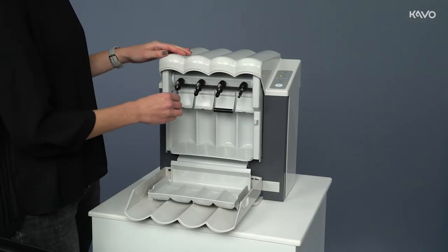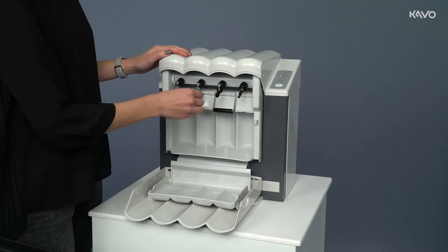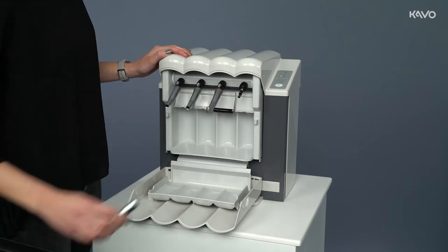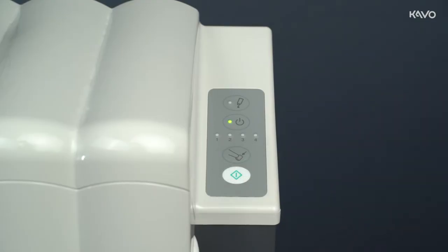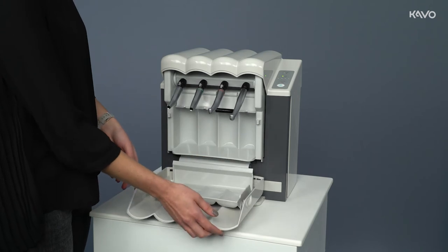QuattroCare Plus is operated in three simple steps. Step 1: attach the instruments to the adapters. Step 2: close the door. Step 3: press the start button. Four instruments can be maintained simultaneously in about one minute. Following the maintenance process, the instruments are ready for the next preparation step.